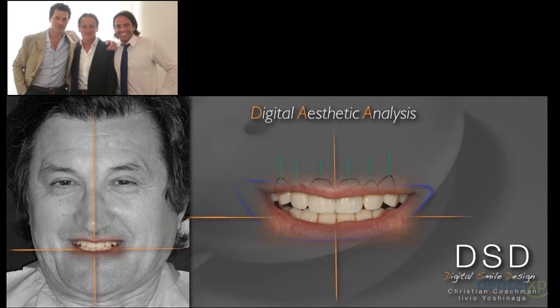They are more receptive. So I think it's a very important tool that we have nowadays. So new technology means yes, zirconia, milling center, CAD, CAM, but it also means computers and digital aesthetic analysis. From my point of view, it's a new technology that can help us and can also help our patient.